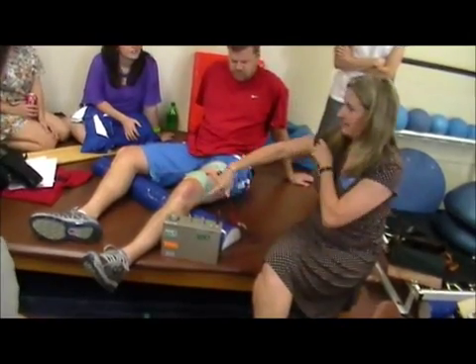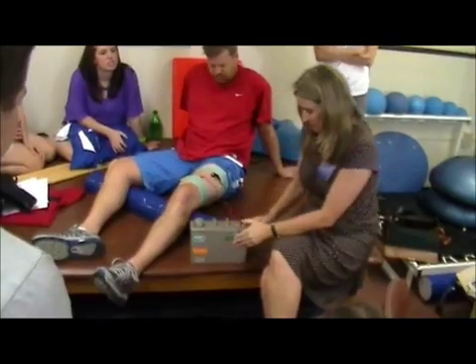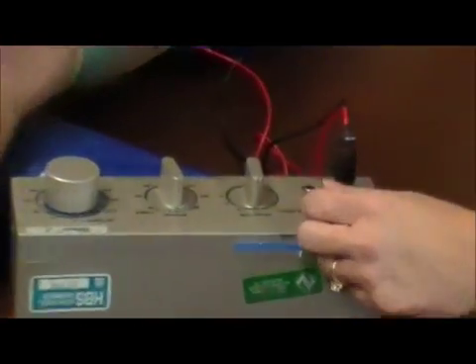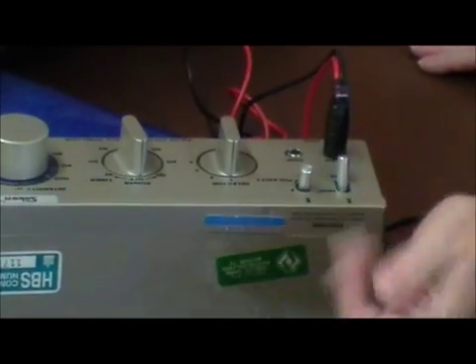Probably would have a slightly bigger bolster under there because that's not really at mid-range, but you'll be able to see the options here. Okay, I'm not using the dispersive pad, so I just have it on pads, which makes this knob ineffective. This is positive, this is negative, so that doesn't matter. It's on pads, okay? I'm going to go through the 4 selectors.